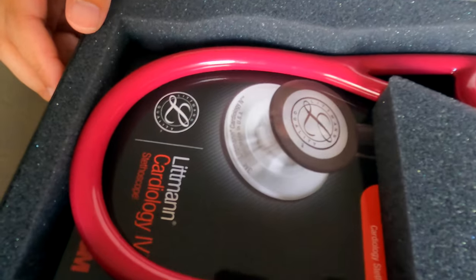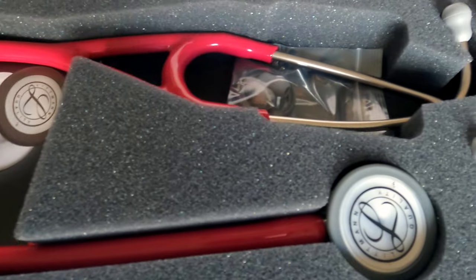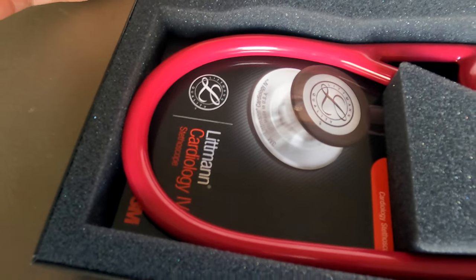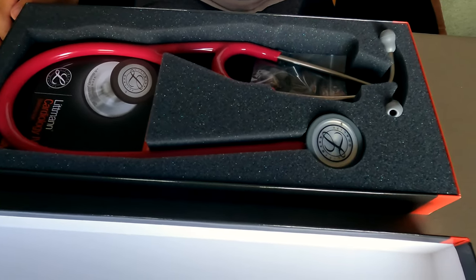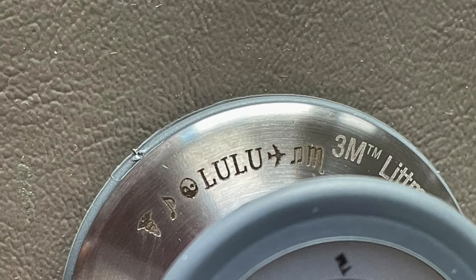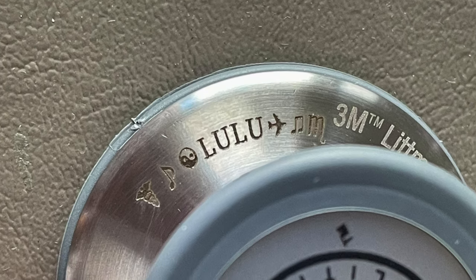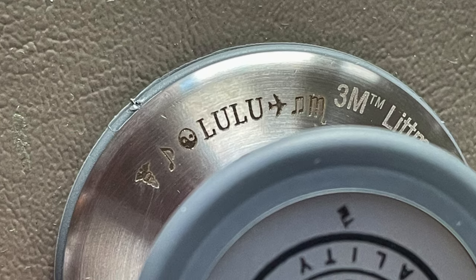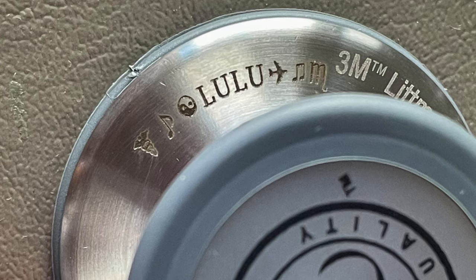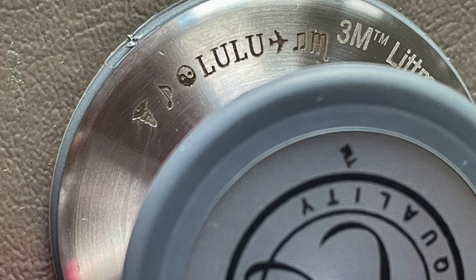I actually picked out the raspberry color for the stethoscope. Pink is one of my favorite colors and I've got to say it looks even better in person — this looks great. I also got a custom engraving. I got a couple of emojis and 'Lulu,' which is the name of this channel. The engraving includes a medical emoji, a music note, the yin and yang sign, an airplane, more music notes, and my horoscope sign.